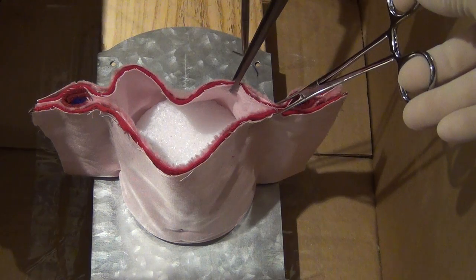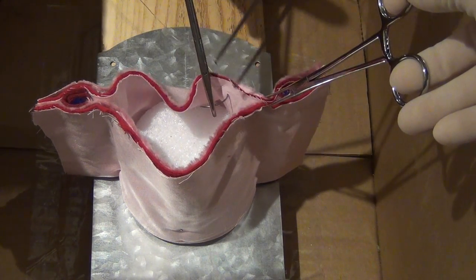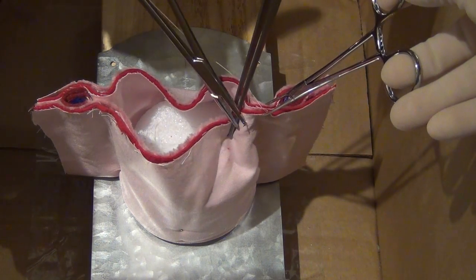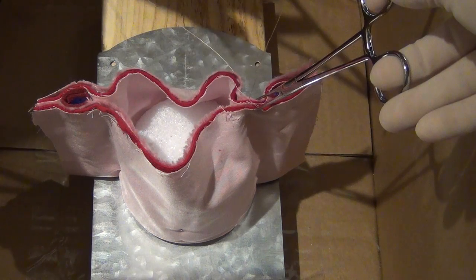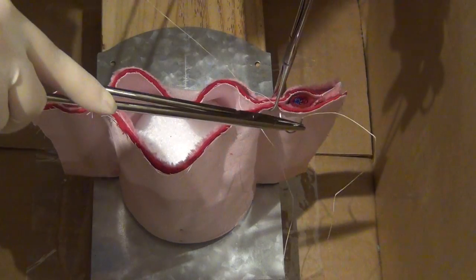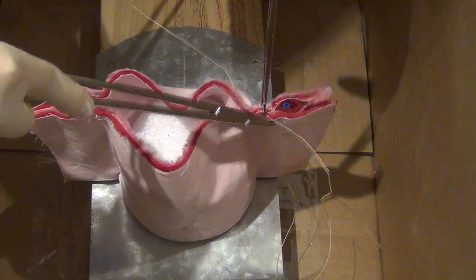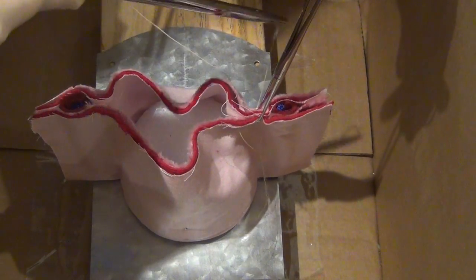Here a Wright-Richardson angle stitch is applied by suturing first through the anterior portion of the vagina, going through the peritonealized surface, through the vaginal epithelium, and then through the posterior vaginal epithelium all the way through the posterior cuff's peritonealized surface. The stitch is then removed and a backhand stitch is placed, which will go through the cardinal ligament. Once removed, the stitch will be tied down and the clamp will then be removed.